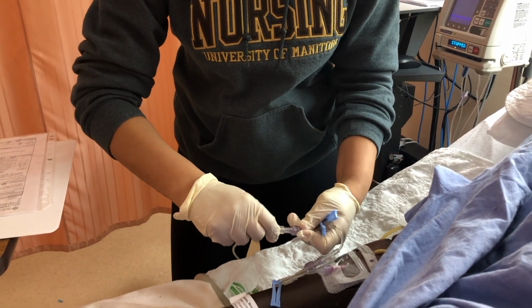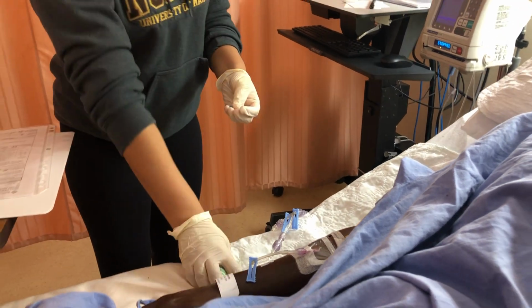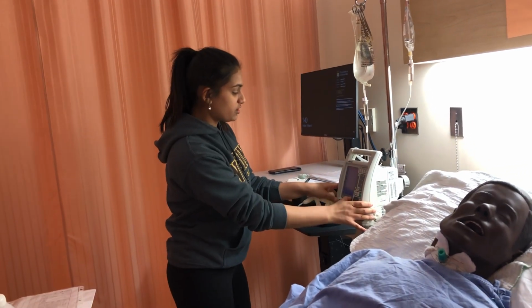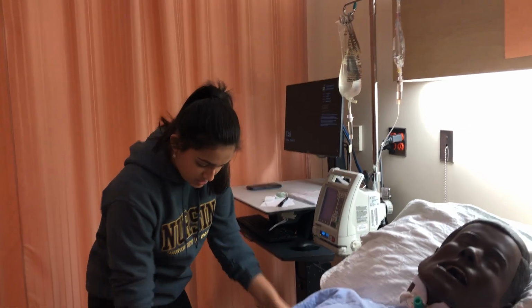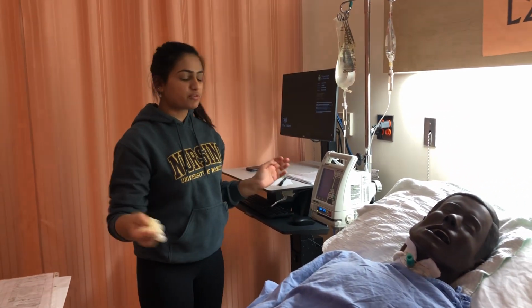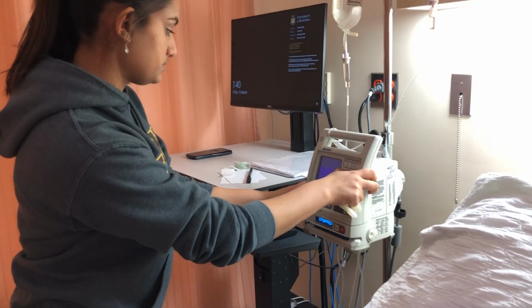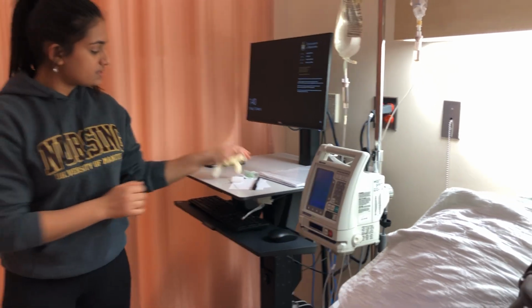Okay, and I'm going to connect it. Right, now that it's connected, I'm going to just confirm the primary. Again, just checking all my settings, and then I'm going to press start. Alright, and just ensuring that the tubes are not occluded, there's no clamps. For the purpose of this demo, since I'll be performing chest tube care, I'm just going to put it on standby for now. Okay, so now that's on standby.